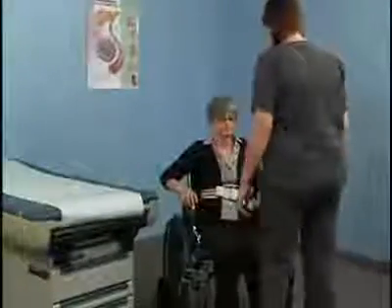Stand in front of the patient with your feet about 6 to 8 inches apart with one slightly forward. Point the toes outward and bend the knees slightly. This position provides a wide base of support for the transfer.